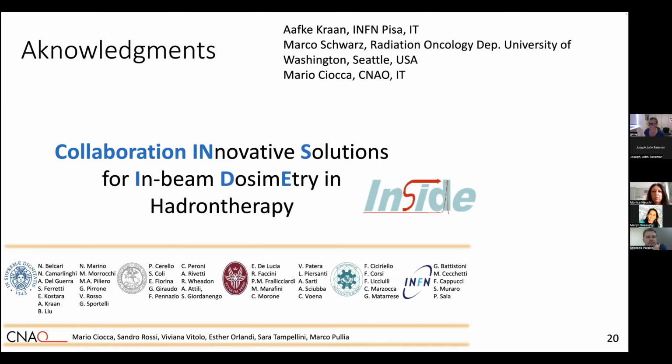Yeah, the detection system is fundamental. And I gave you a few hints of the complexity of the systems that can be and must be realized. For instance, I'm more of an expert on PET imaging because it's my work. And I showed you some examples of what we can get with in-beam PET, but which is not the best that we can get, because the hardware has limitations. For instance, our system is not time-of-flight grade PET, and time-of-flight PET could allow us to solve a lot of problems with the image artifacts that we observe in our acquisitions. So this is only one example of what we can do to improve our system.